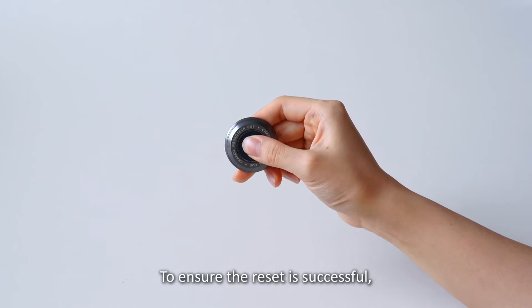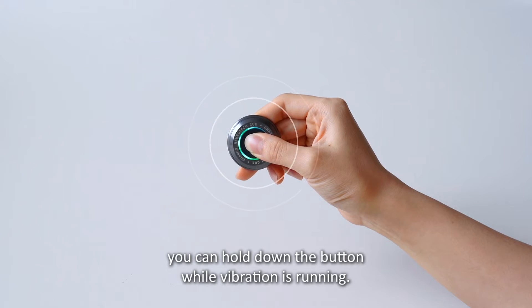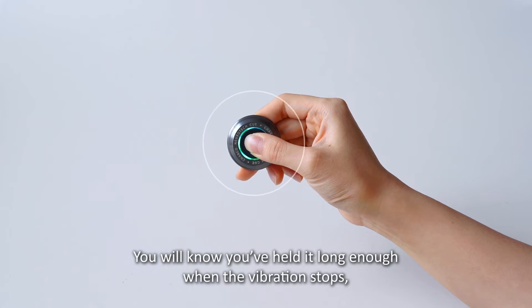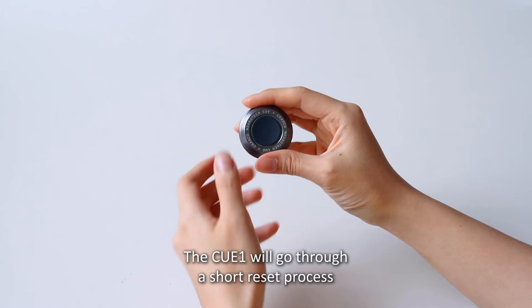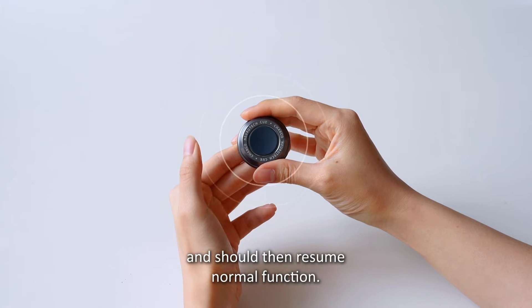To ensure the reset is successful, you can hold down the button while vibration is running. You will know you've held it long enough when the vibration stops. Then you can release the button. The CUE1 will go through a short reset process and should then resume normal function.